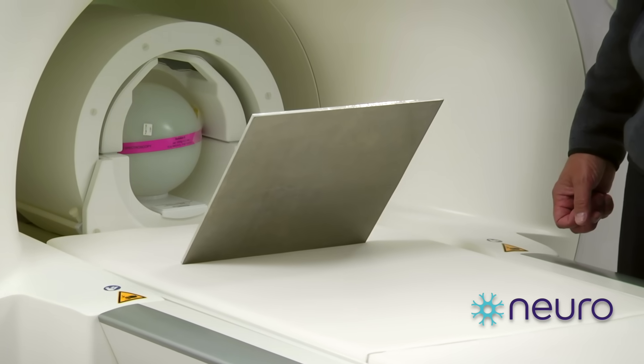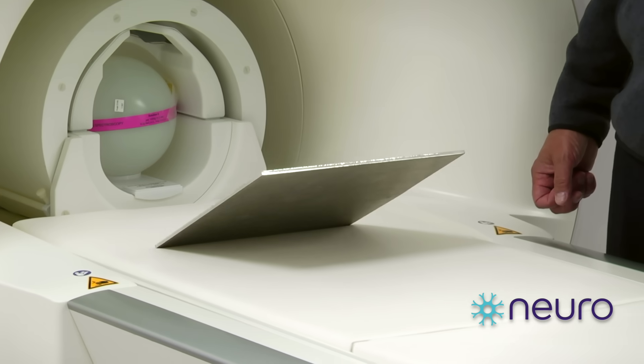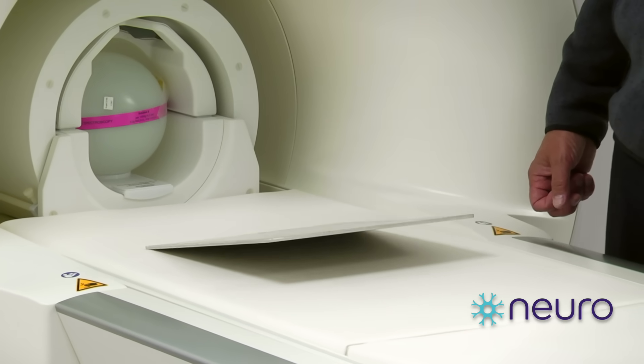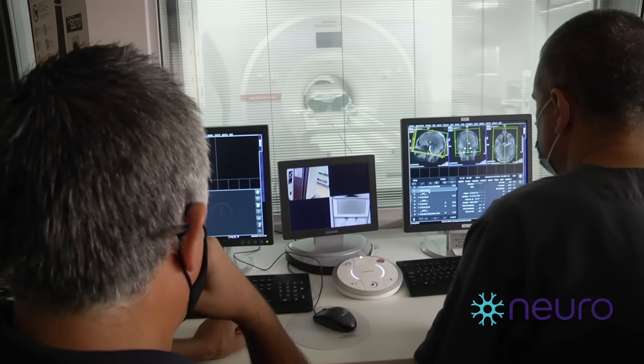I find this serves as a really good visual demonstration of just how powerful the magnetic field is, and this is what's required to create the polarization of the atomic nuclei in your body that we use to generate these images.